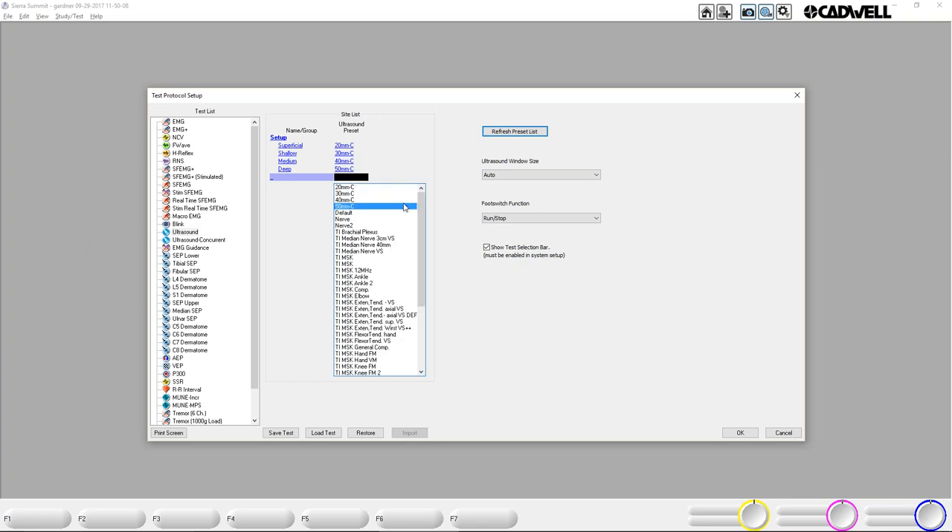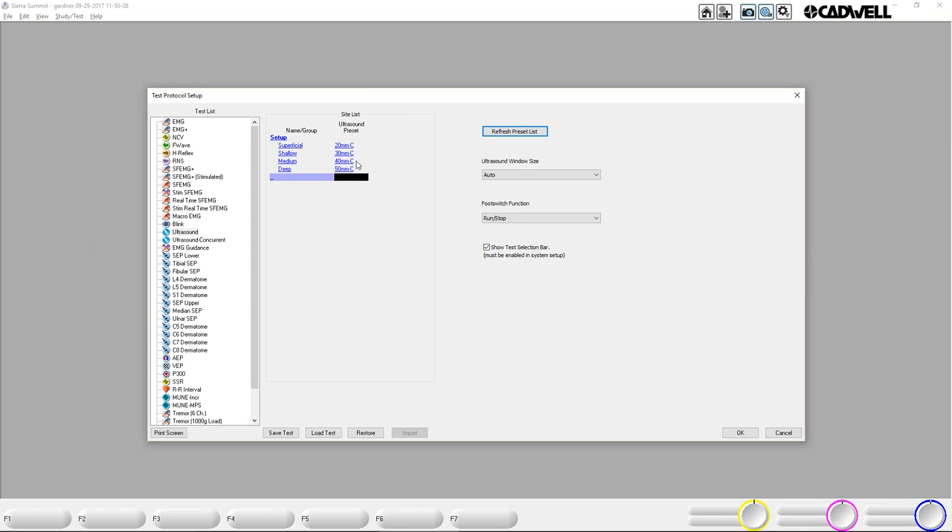I've refreshed the preset list, so now I can see all the presets in the system and select a different preset for a site or structure. My presets are going to come as superficial, shallow, medium, and deep — and there's a reason for that. I always set the ultrasound window size to Auto, which uses as much resolution as the software allows. On concurrent mode it goes full screen if there's a dual monitor; on regular mode it takes up approximately half the space Sierra Summit allows. I usually encourage reps to quote the foot switch with ultrasound. I usually set it to Run-Stop — that allows them to review back and find the best picture. Store just takes a snapshot. You can also decide whether to use the test selection bar.